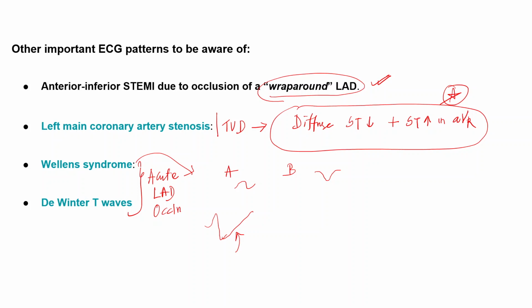You just have to know what to look for in real life. Everything, the WPW pattern, all the bundle branch blocks, all the AV nodal blocks, they are not uncommon. If you go to the wards or the emergency department, you'll be seeing all those ECGs.